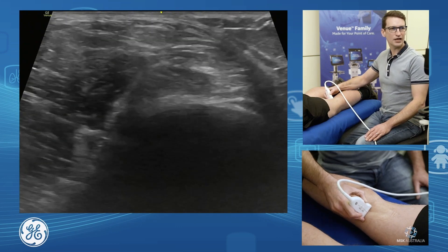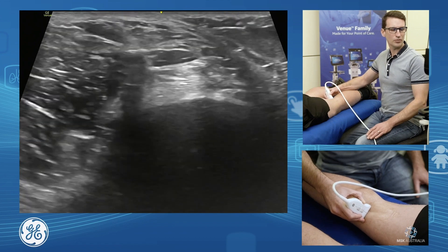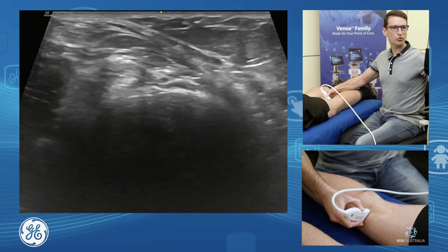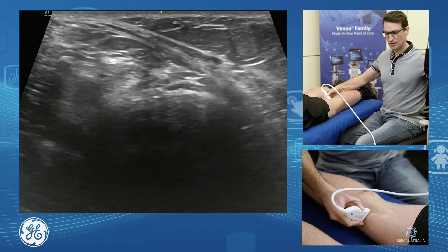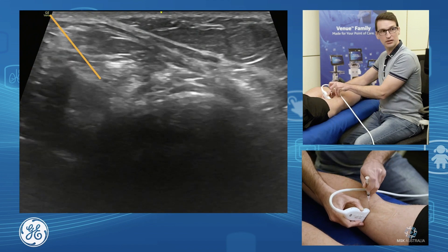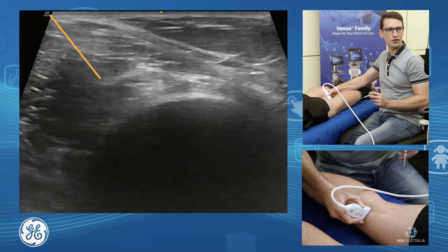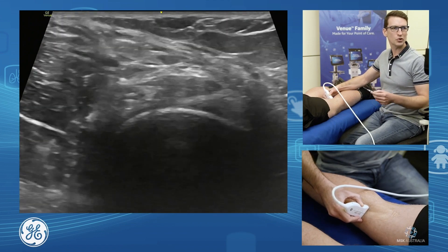We might need to aspirate our Baker's cysts. What we do is find our Baker's cyst, move our probe around medially to give ourselves a little space, and then it's just a simple dropping almost vertically down into the Baker's cyst, away from any arteries and nerves. And that's our posterior knee.